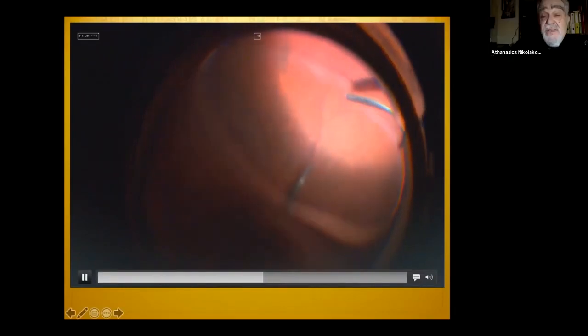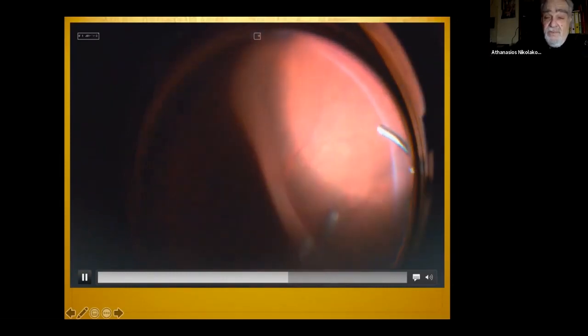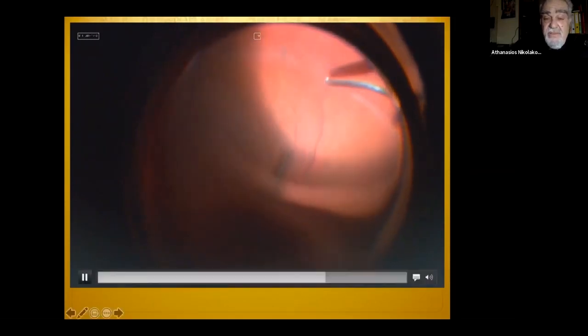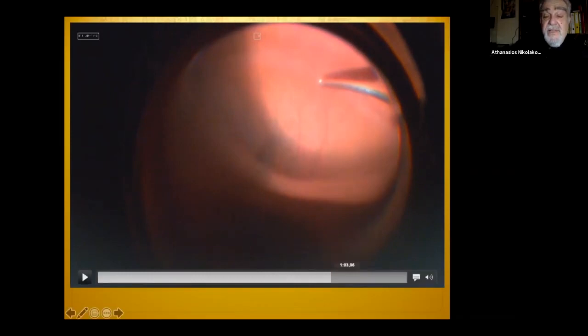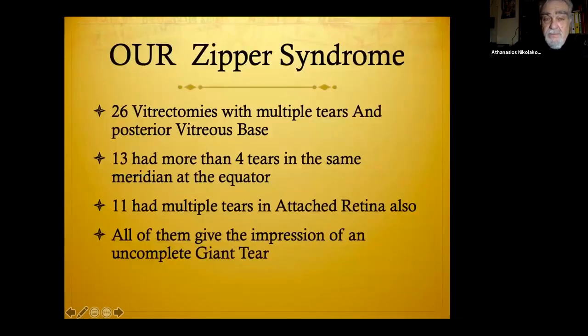It's very clear that this vitreous bridge here is the posterior vitreous base that cannot be cut off. You try to chew it, you try to cut it, and it stays there like it is. And this is creating different tears in different areas, as you can see here. Here it's very, very distinct. You can see the traction, you can see everything. And you can see the folding. It's like having a vitreous attachment, a second retina on this area. We just tried to separate them.